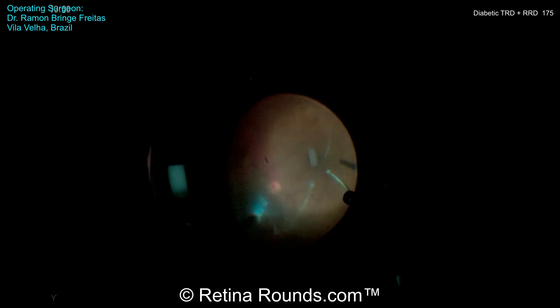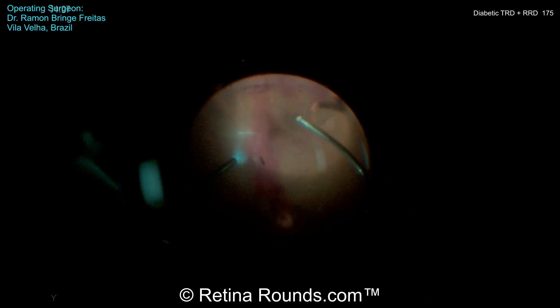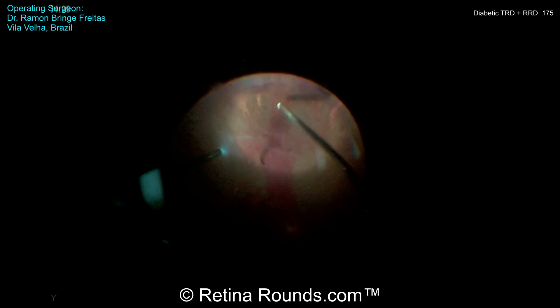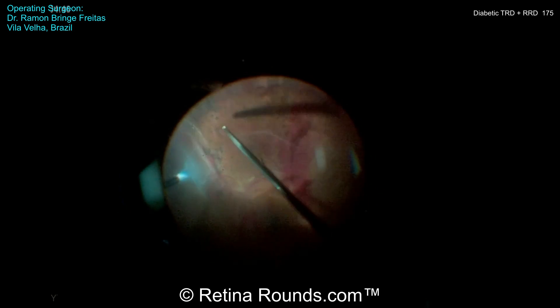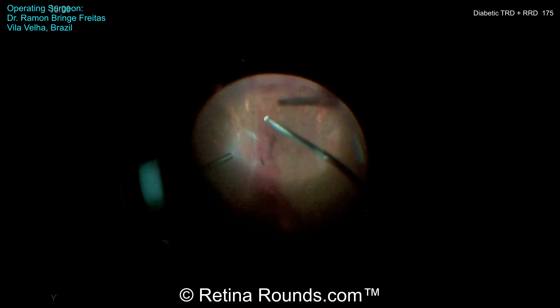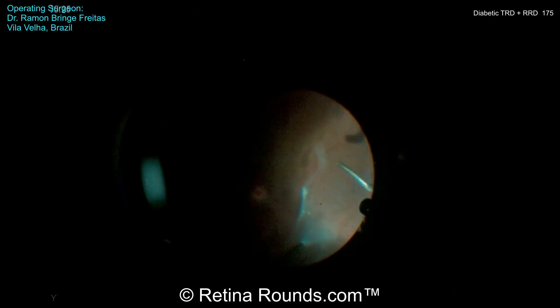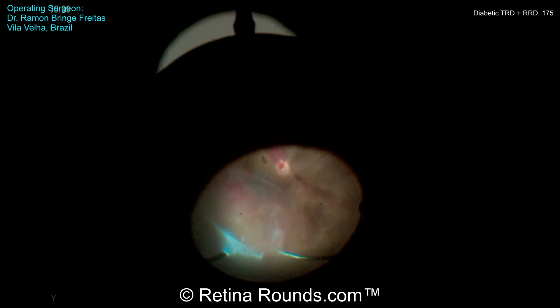Starting at the beginning of the case, this is a 25-gauge pars plana vitrectomy. This is a phacic diabetic patient who has undergone some prior panretinal photocoagulation. Dr. Bringhe Freitas is going to start by performing a core vitrectomy. It appears in the inferior and potentially also in the nasal quadrant that there is a partial posterior vitreous detachment. He is focusing his efforts roughly at the level of the equator, and that's going to serve two purposes: the turbulence from the vitrectomy is going to help propagate that PVD, and it's going to help him segment the anterior and the posterior cortical vitreous.